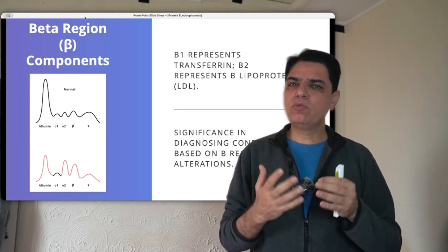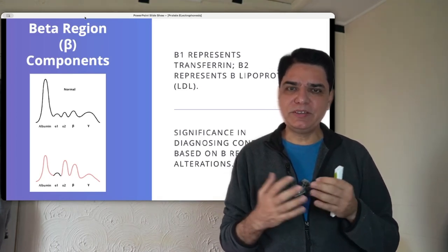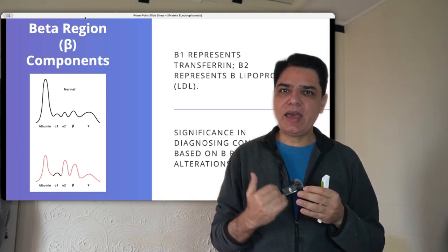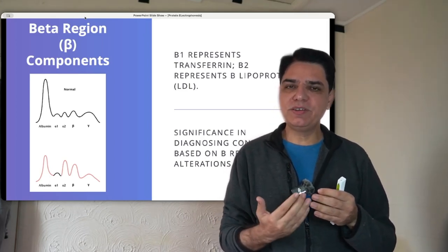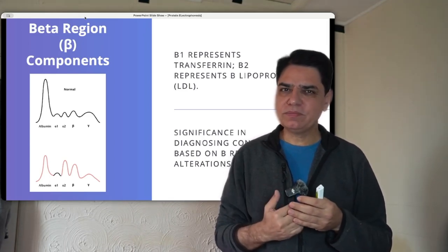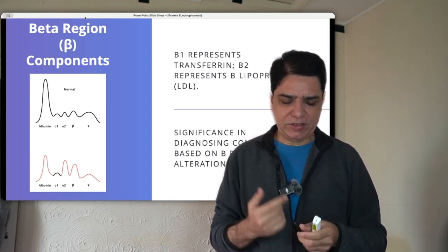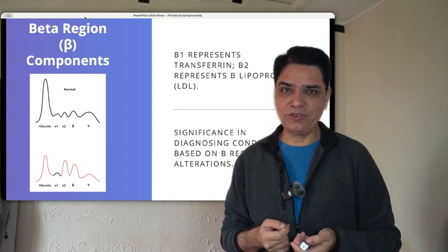So what do you think? Can you explain this? A decrease in albumin and an increase, which you call a compensatory increase, in the alpha 2 and beta globulins. Think on that. And yes, you were very right if you guessed correctly. That is nephrotic syndrome, okay?